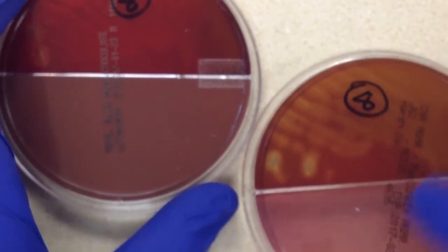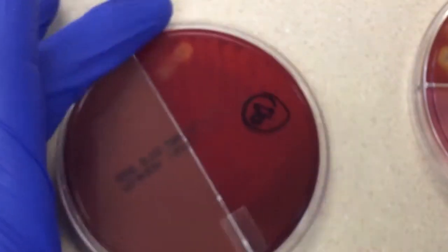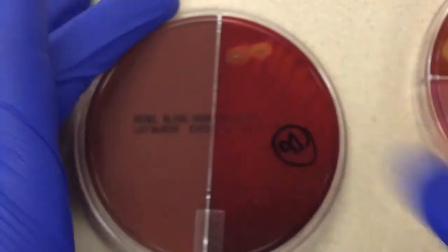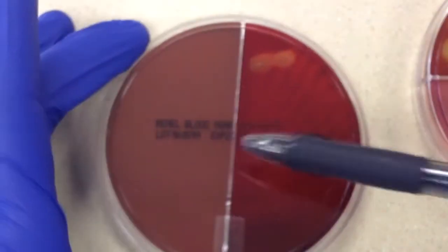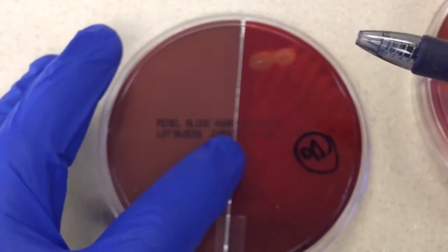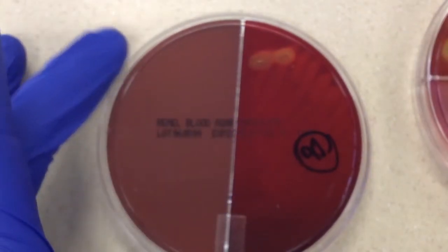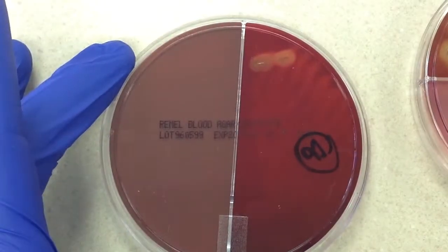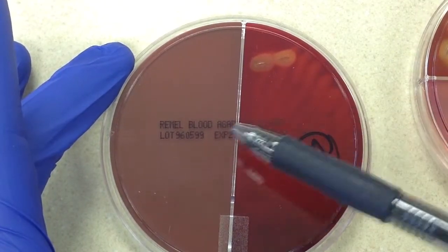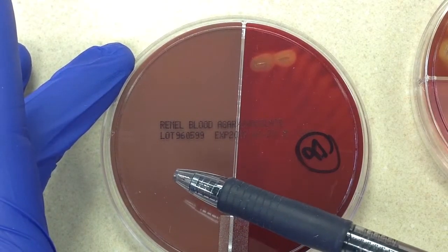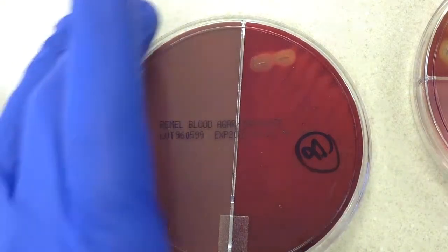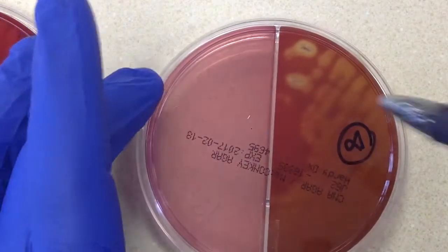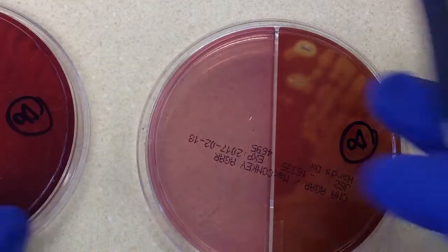So on this particular culture, let's see if we can get it to come into focus here. It's probably driving you guys nuts. Okay, there we go. So we have a bi-plate of chocolate and sheep blood, and then we have a McConkey's and CNA.